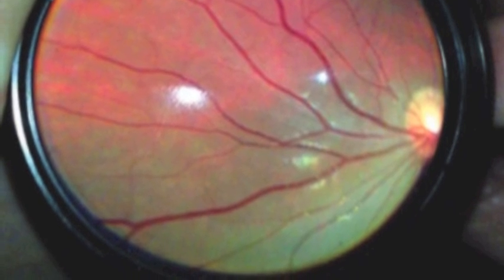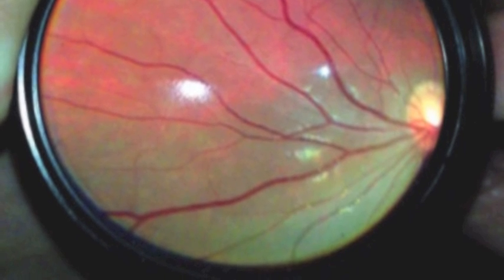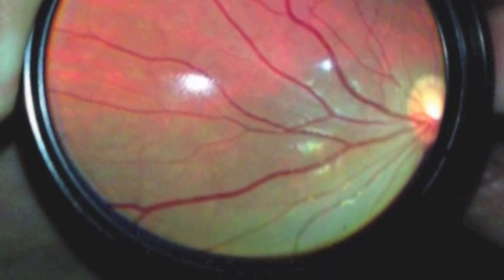You may initially experience some difficulties with this technique. Common problems include blurred vision. This may be due to being too close to the patient or because your distance vision is not corrected. Double vision. Vertical double vision may be due to tilting of the head or instrument or due to decompensated vertical phoria. Horizontal double vision may be due to incorrect PD adjustment of the instrument, being too close to the patient, or a decompensated horizontal phoria.